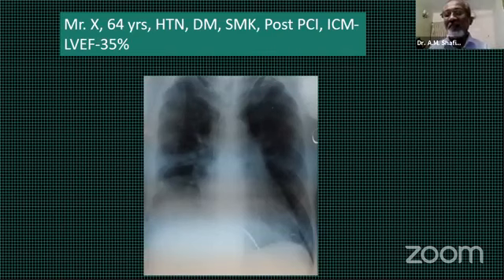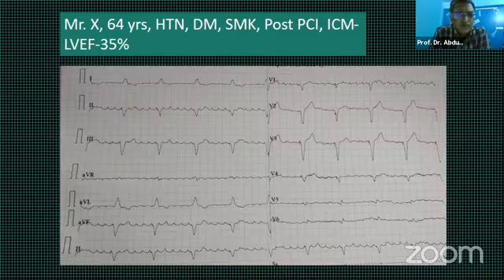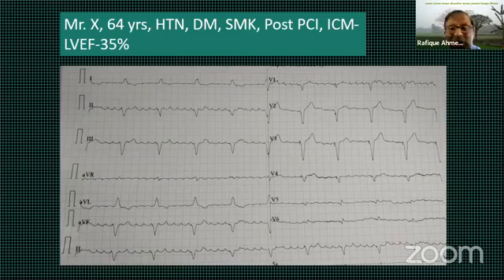Can I go back to the previous ECG? Okay. Sir, I have a question. This patient has an EF of 35%. So if I can convert the flutter rhythm into sinus rhythm, there will be an atrial contribution to the ejection fraction. So for that contribution, do you do the DC conversion for this patient? Do you advocate that? I think I plan to. I think we should wait until he finishes the case. Right. I think this is a good point that we need to make.